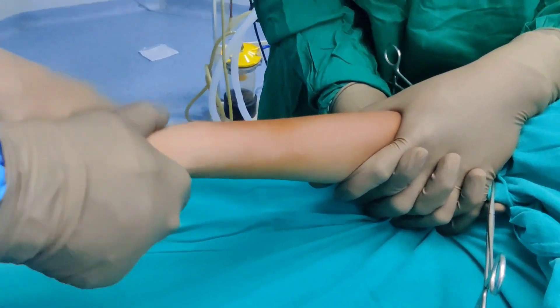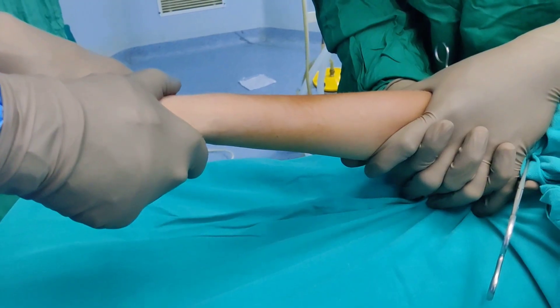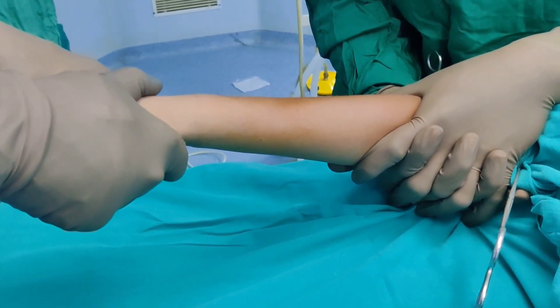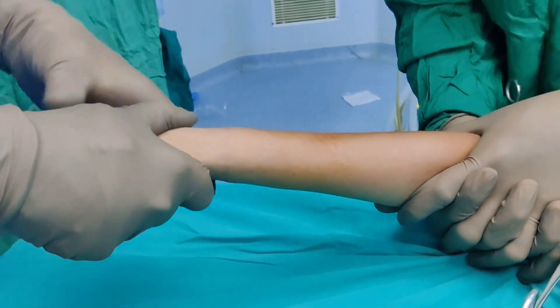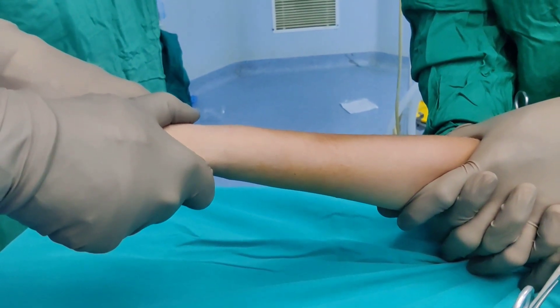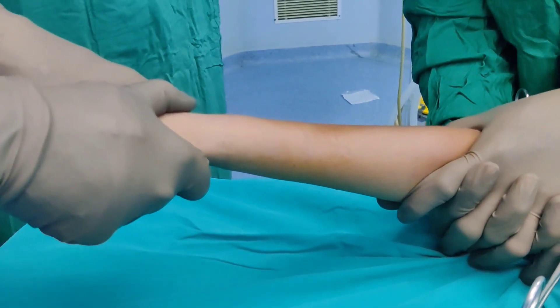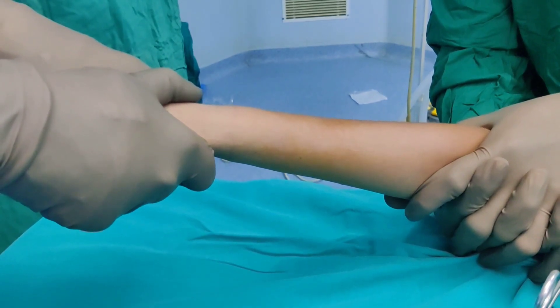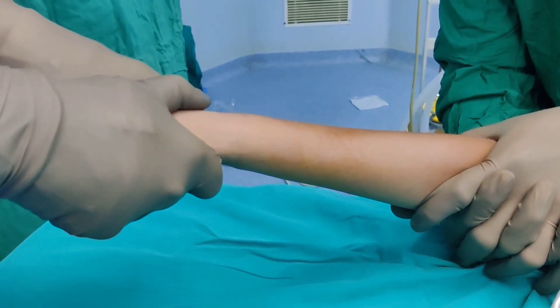Traction and counter-traction is all you need in this particular case. However, if there was no contact and the distal fragment was completely overriding the proximal fragment, I would have exaggerated the deformity and then reduced it before giving longitudinal traction. If both fragments are completely out of contact, do not start with longitudinal traction — first reduce to get some contact and then apply traction. If you maintain traction for around 2 to 3 minutes, most of the time it will fall into an acceptable reduction position.